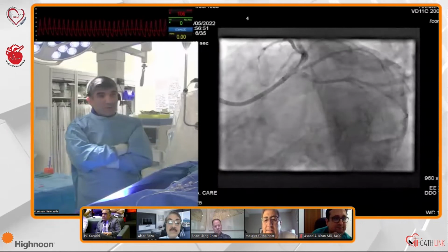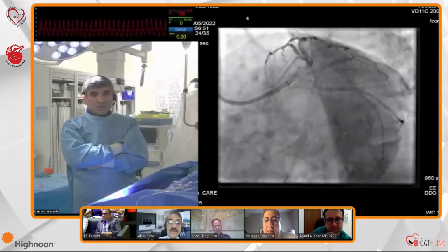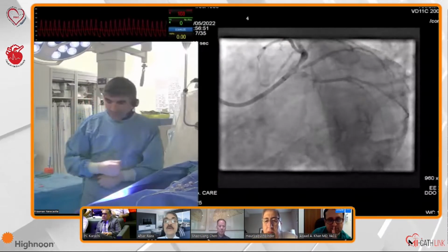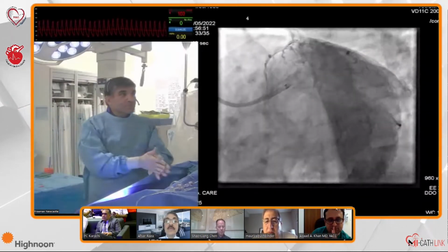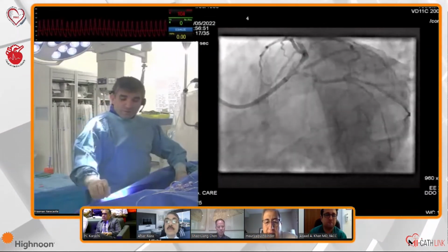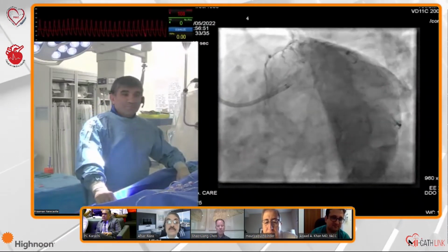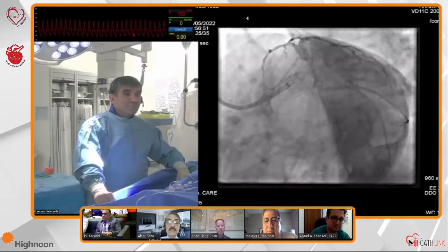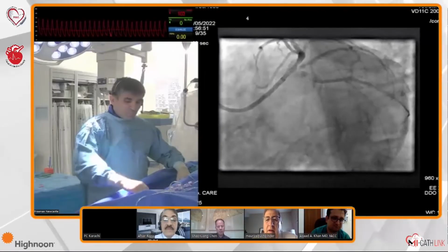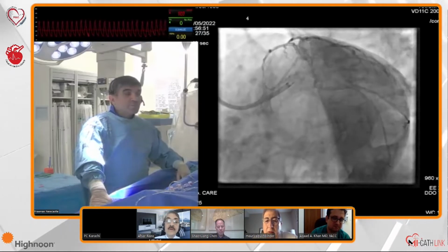Right, thank you. If I get you right, just to interject here, a single stent strategy, but you leave the circ alone, or you try it with a cutting balloon. To me, the ramus looks slightly bigger, but I'm not sure in this view. I'm just interested in what you would do with the circumflex. No, I think it's a big area of supply to the myocardium. We can't ignore that. We need to address this as well, otherwise the original symptoms will stay. Yes, I would do the circ. Personally, I would treat exactly the same, but more circ and the left main LAD.